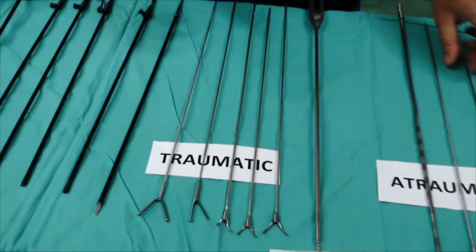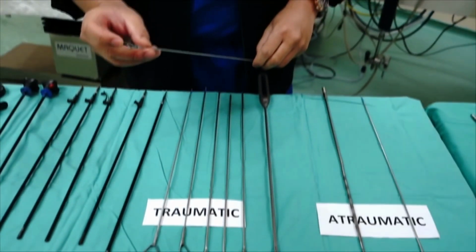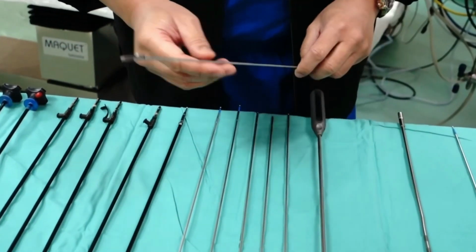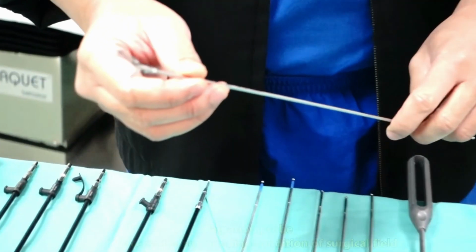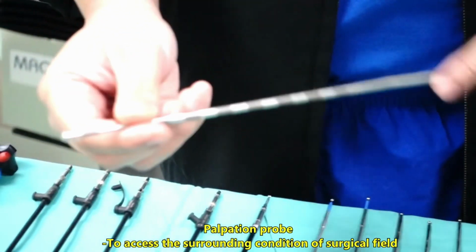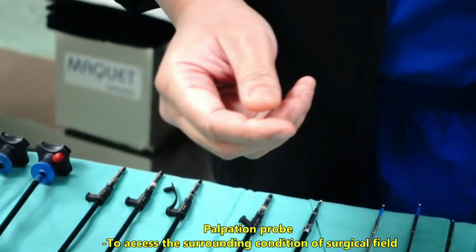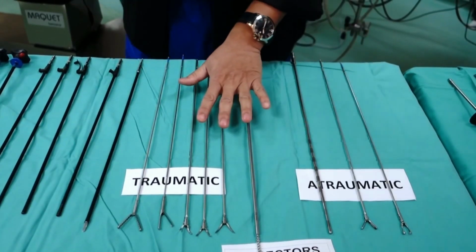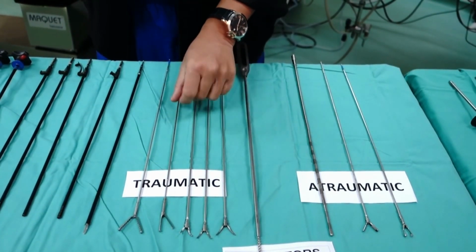So you have to know what type of instruments you want to use during surgery. Now, usually when we put in blunt instruments like this, it is to assess the surrounding area when you put in your first instruments. Palpation probes are the usual instruments that you use when you go in, just to assess the surrounding condition of your surgical field.